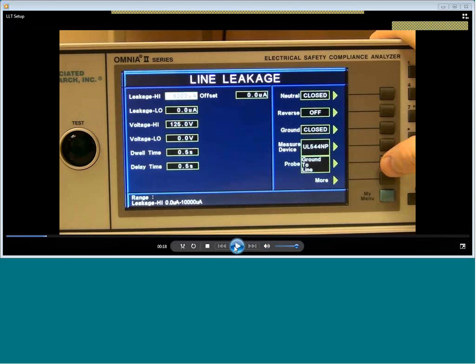And obviously you might not be using our leakage tester, but any leakage tester that you're using should have some sort of limit that you can either set or a hard set limit depending on the test that you're running. So to keep things simple, for the case of this demonstration, I'm just going to set my leakage high limit at 1,000 microamps, which is a pretty common high limit. I'm just hooked up to a dummy DUT anyways.